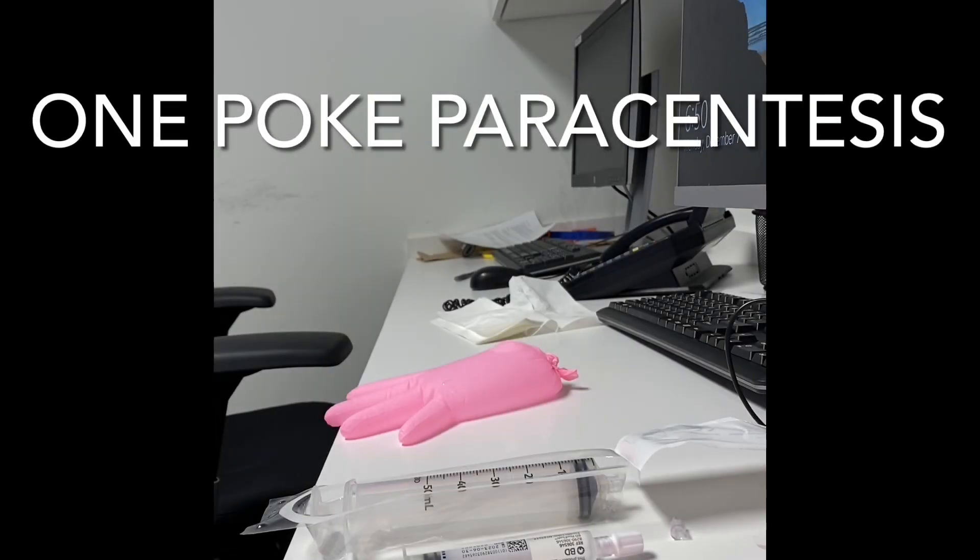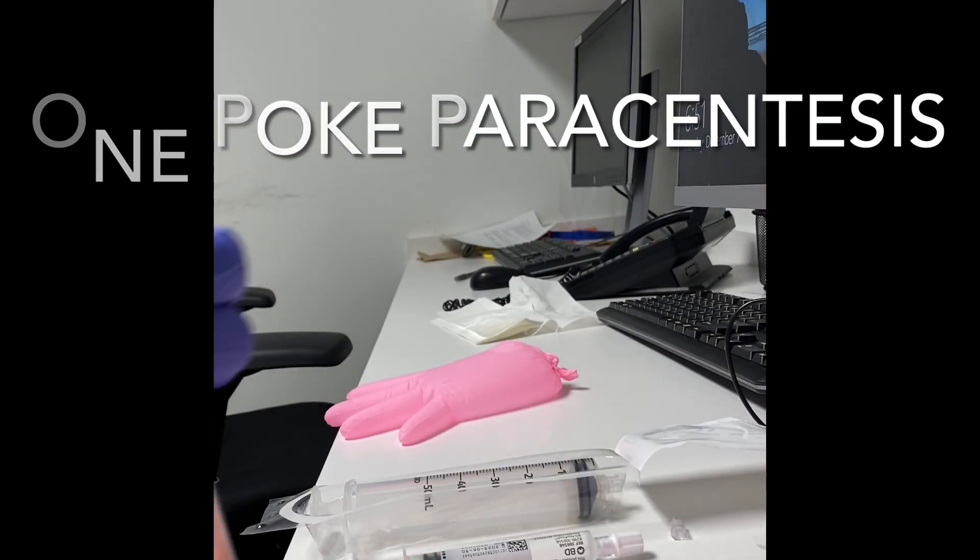Here's an example of how to use the 20 gauge angiocath to do a paracentesis with just one poke. Here's the angiocath we'll be using.